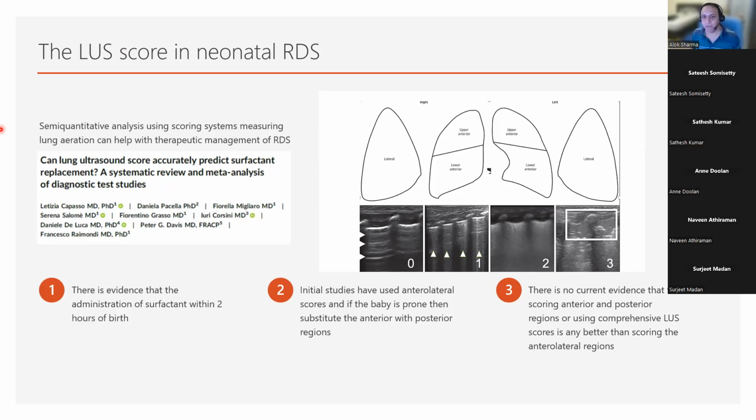So what is really important is that we clinically correlate, and the same applies to lung ultrasound. Now, again, what I'd like to emphasize is the scoring system based on morphology over here, as you can see, and the profile. So, 0 correlates with what I'd say is an A profile. 1 is somewhere between an A and a B profile with B lines and some aeration.